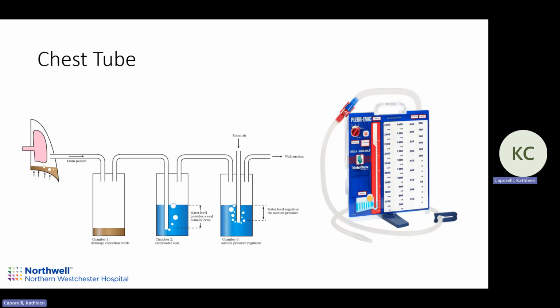So you can actually turn this dial and change it from -20 of water, again that pressure level, -10, -40, -15. And when you do that, there's a little orange indicator that will pop out once it's actually on suction. So if you don't see this orange thing pop out once it's on suction, this isn't actually on suction. And it's actually very dangerous if you have it hooked up to the suction and you don't see that, because now it's a closed system, right?